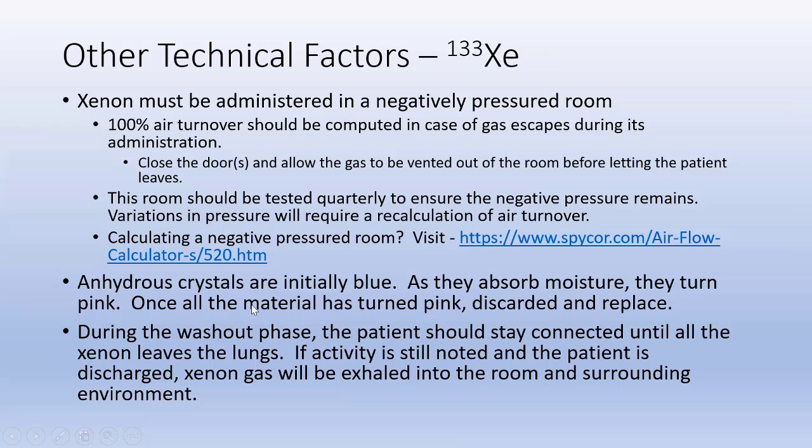Again, I indicated earlier, anhydrous crystals, they are blue initially. When they absorb moisture, they slowly turn pink. When they all turn pink, it's time to exchange those crystals with new ones, and they need to be replaced so that you continue to not have moisture within the system. And then, of course, during washout, please realize that if there's still xenon gas in the lungs, then you need to wait and not disconnect them until they have exhaled all that out of their lungs and captured by the charcoal filter.